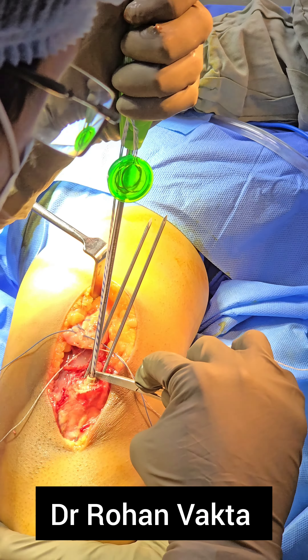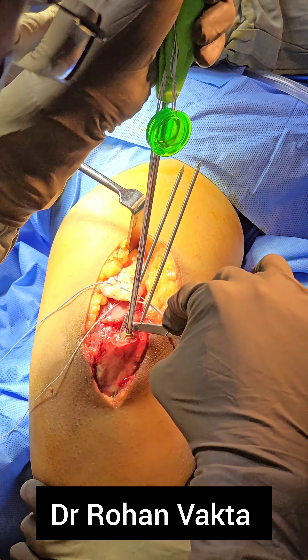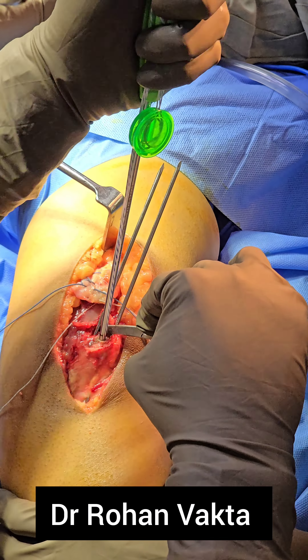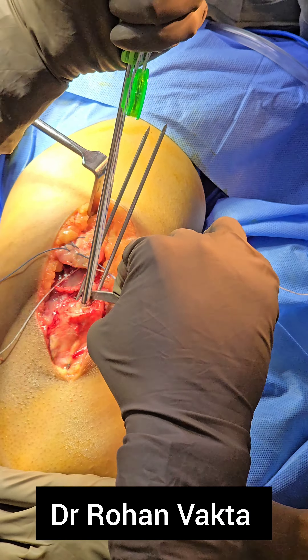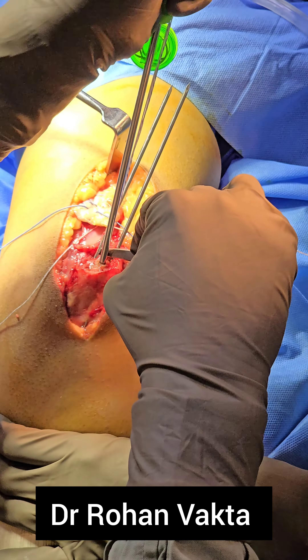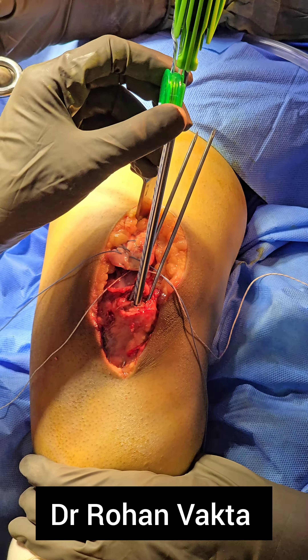This suture anchor will also be used to repair the triceps tendon. As this is a female patient, the size of the olecranon is very small, so only one suture anchor is being used. Along with the suture anchor, for robust repair and to allow early mobilization, two transosseous sutures will also be passed.